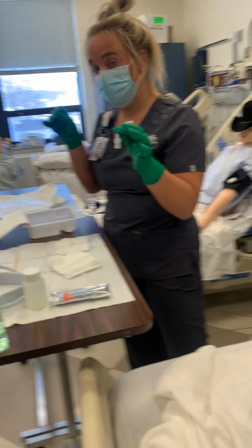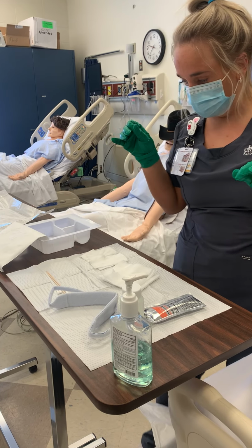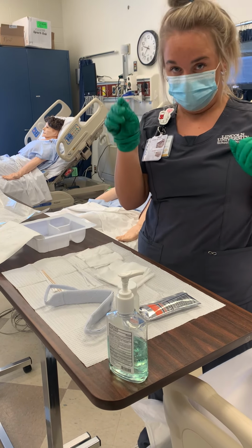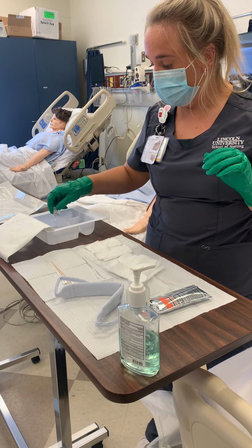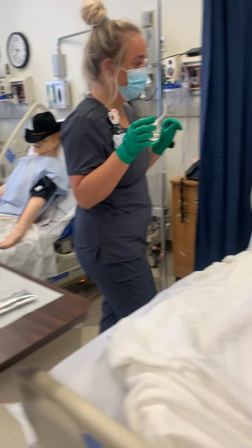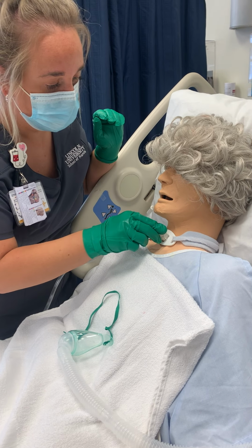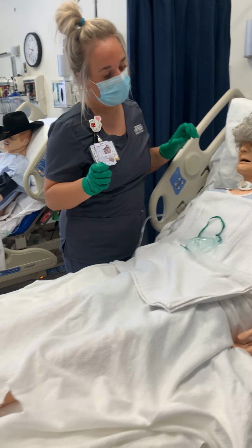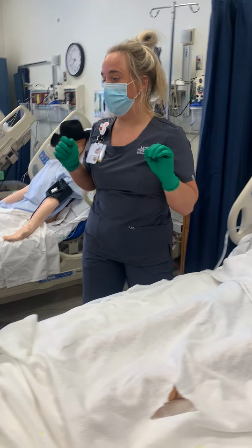Okay, so I can go ahead and put it into the normal saline. Then I'd give it a second. Now with my clean hand, I can go ahead and take it back out. I'm going to tap off that excess fluid on the inside, bring it back over to my patient, and insert that back in until I hear the click. Add the oxygen for a minute while I get my cleaning supplies.